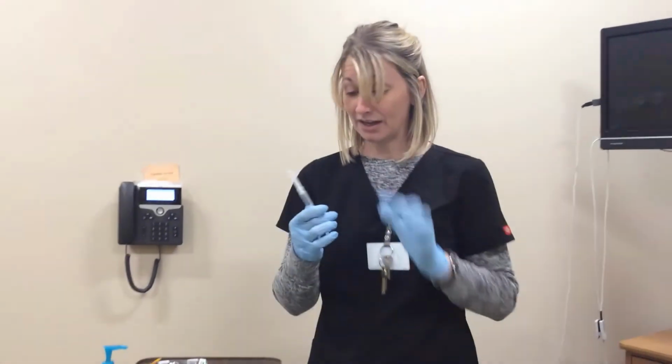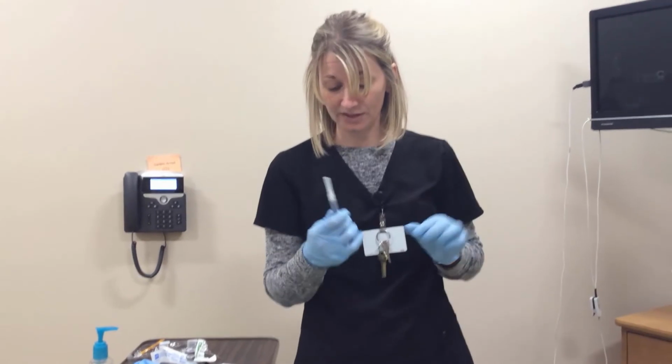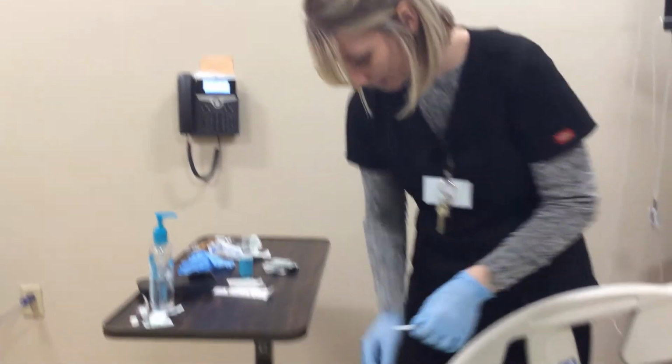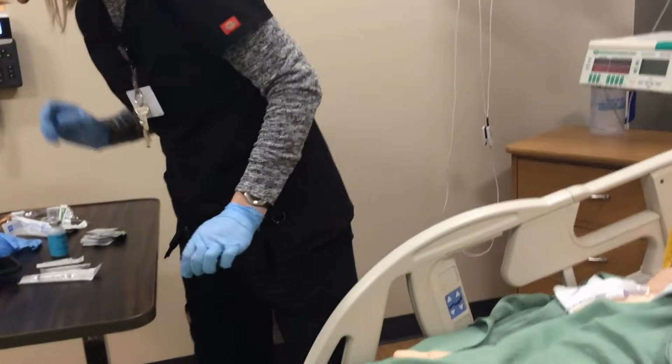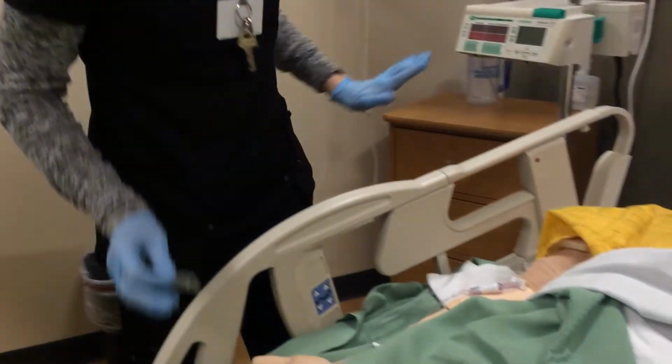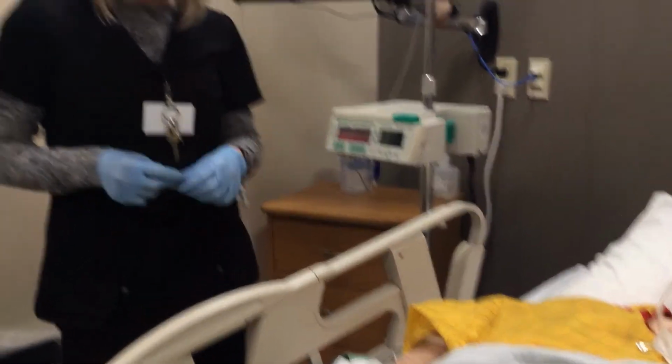15 minutes of prep time again. I checked my drug prep to see how fast I can give this. I can give this over like 3 to 5 minutes. Okay, so I've got my Solu-Medrol, I've got my buffer, and I need some alcohol. All right, so I've already put my pump on hold.